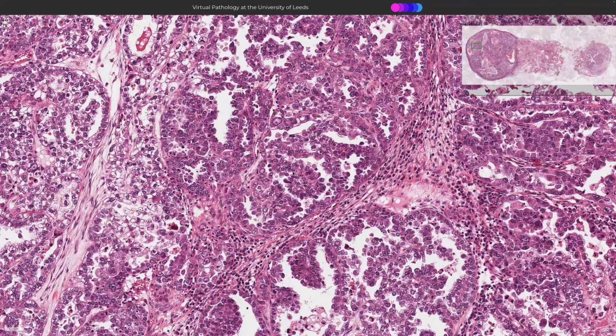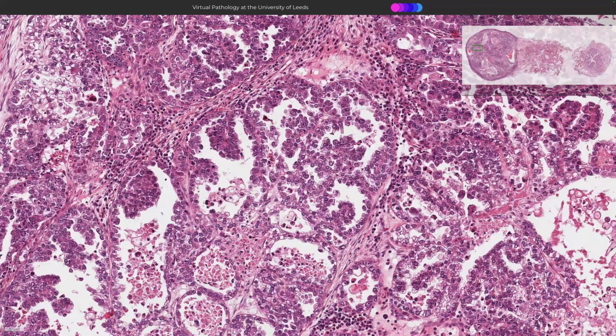So now you're going to say, but Diane, serous carcinomas can look like this. And I go, aha, you're right. They can look like that. The hobnails here in clear cells, when you've seen a lot of them, you will see that they are larger. The cells are larger than the hobnails in serous. And it's always important to look quite carefully if you're trying to tell the difference between this micropapillary pattern for the little patches of clear cells.